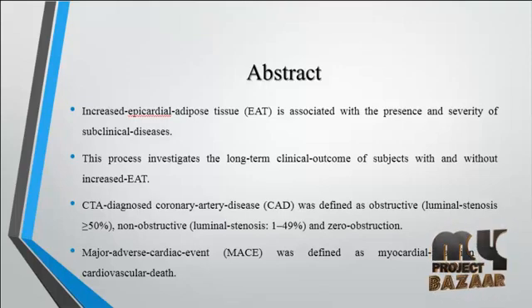Hence, the CTA diagnosis of coronary artery disease, that is the CAD, was defined as obstructive luminal stenosis greater than or equal to 50%, non-obstructive luminal stenosis 1 to 49%, and zero obstructions. Hence, the major adverse cardiac event, that is the MACE, was defined as myocardial infarction or cardiovascular death.